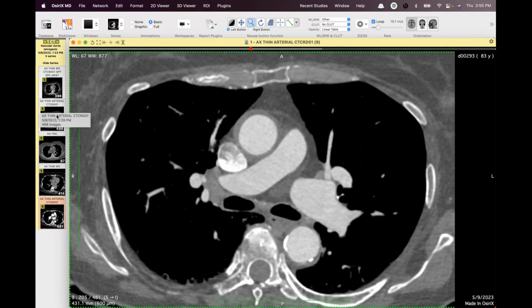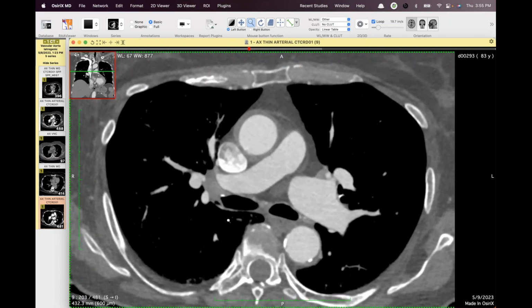So when did you get your photon counting scanner installed? Recently, or has it been a while? No, we've had it since we were one of the first three. Yeah, it's been a year or so. How are you doing? We're having some issues with ours, to say the least. I'd be curious. We had to do a lot of work tailoring it. I'm glad you have one because I need to pick your brain, because we're struggling. I personally think it's a glorified flash scanner for what we do.